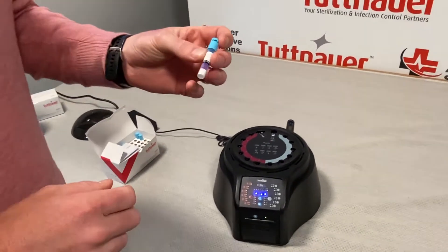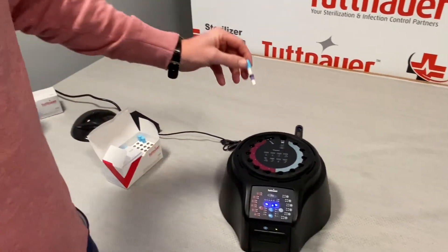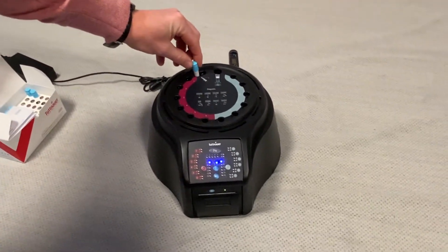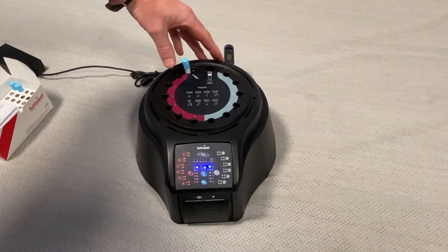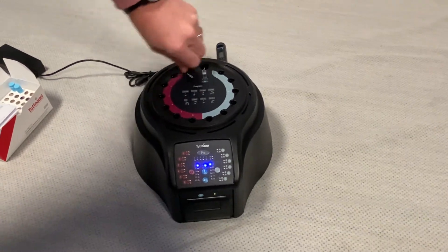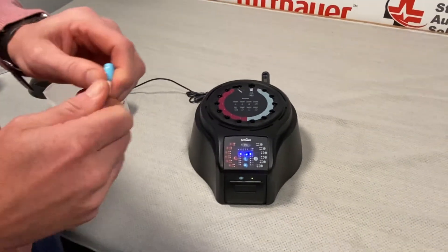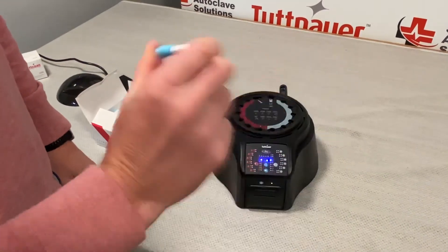To activate the indicator, we're going to press the blue cap all the way down and then put it into the activation slot in the back. What this is going to do is break the glass vial for the incubation liquid. All we're going to do is push it side to side really fast — one, two, three times. Take it out, roll it, make sure all that glass is broken and the liquid is seeping out, and give it a good shake.